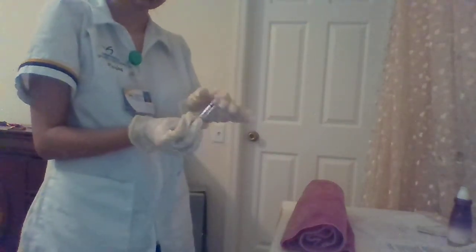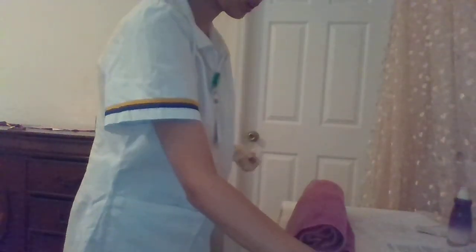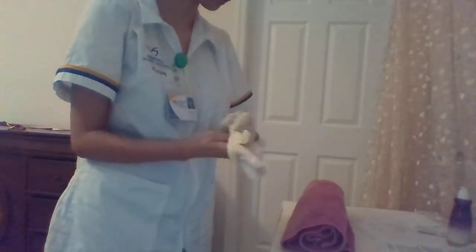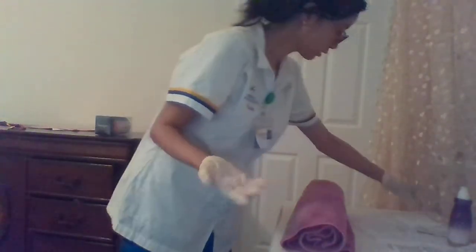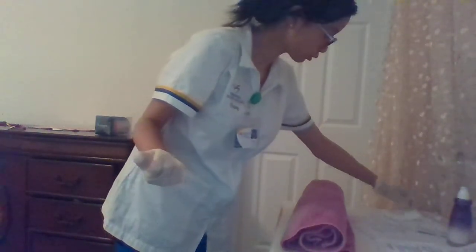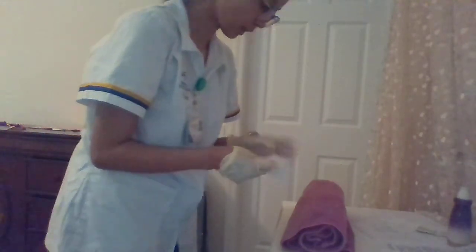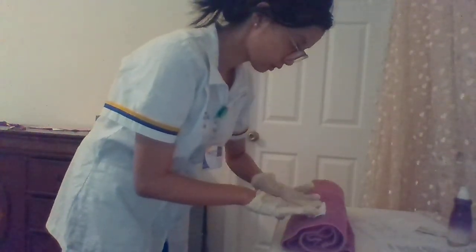And I'm going to engage the safety and then dispose of it in the sharps container. So right here. And I am going to use the gauze to apply gentle pressure on the injection site.